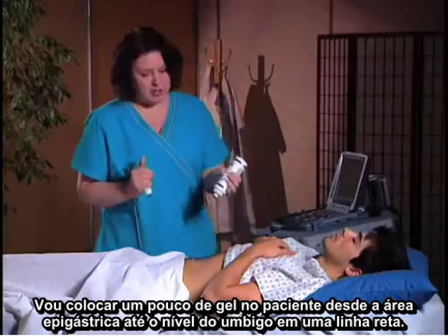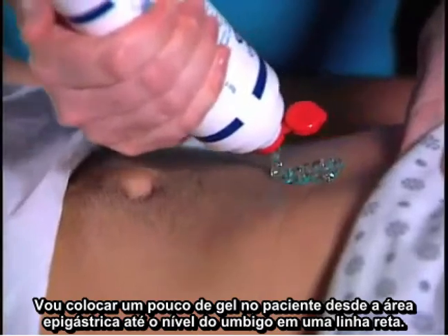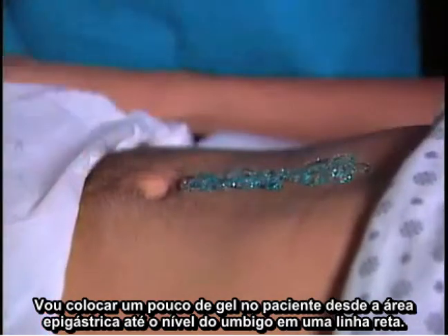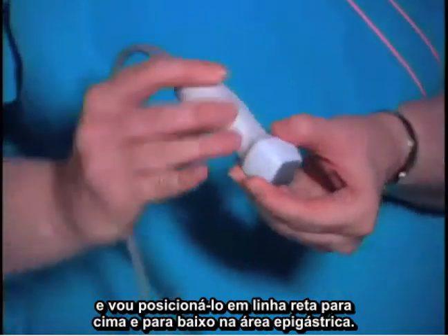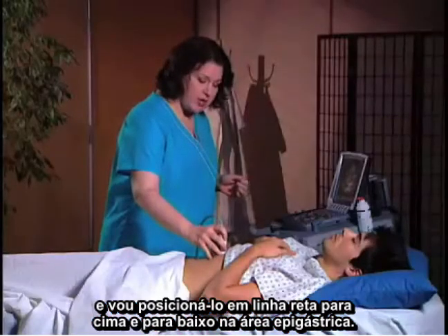I'm going to put some gel on the patient from the epigastric area to the level of the umbilicus in a straight line. I'm going to orient the transducer so the marker is to the patient's right, and I'm going to place it straight up and down in the epigastric area.